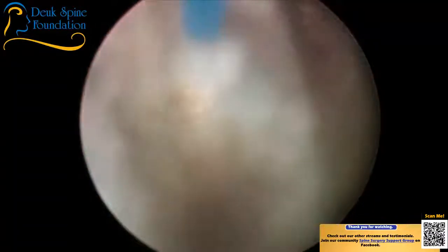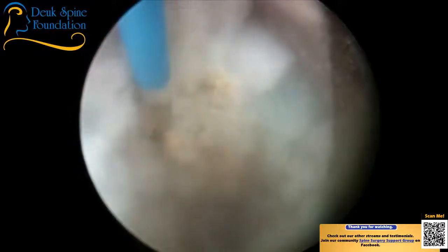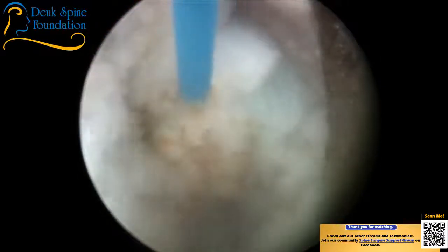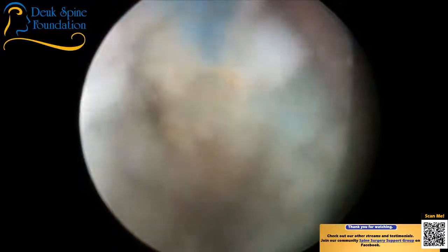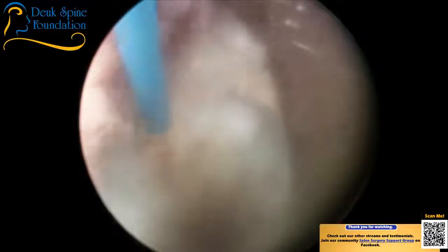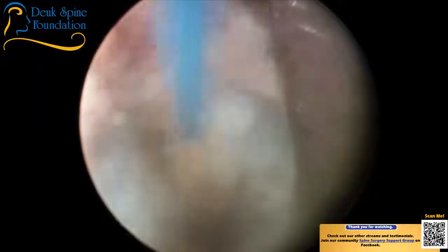Problem is if I pull on the scope to get medial, you'll break the scope. Right, Luis? We've done that before. It's where you pop the lens on the scope. And then we have to spend thousands of dollars to fix it. So good news is I'll be done in 2 minutes here.